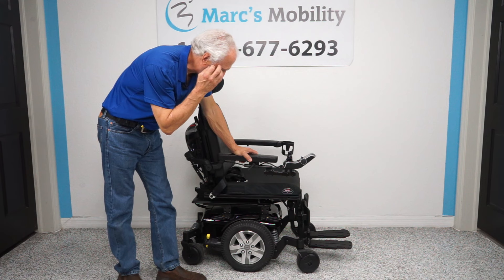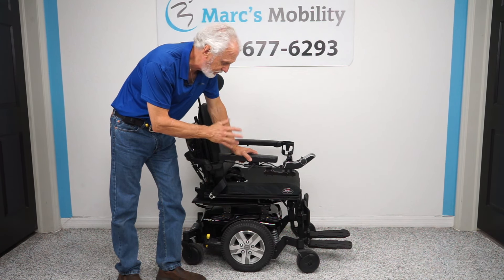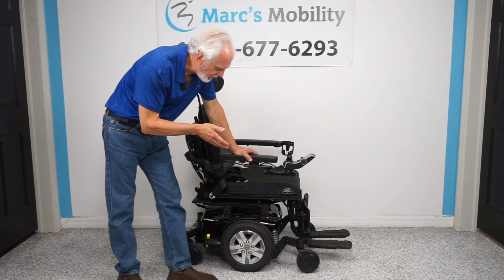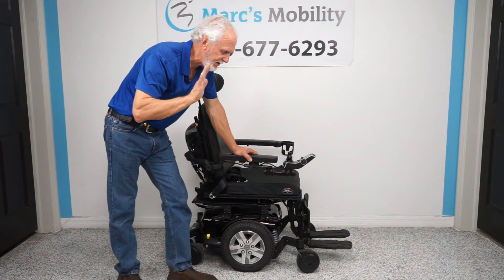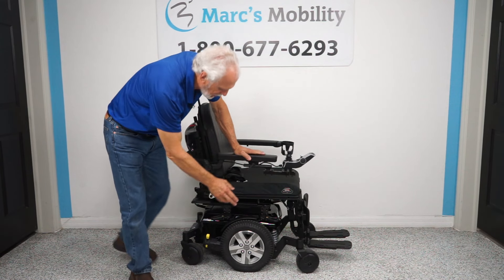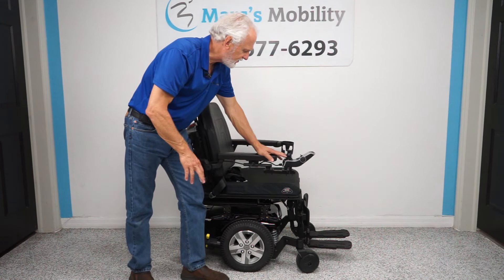We have a really nice chair here. Most of the chairs that come through my office are literally brand new, because we're very picky about the chairs we buy. This one has 19 miles on it and was used less than a month. It has electric tilt, electric recline, and electric feet. The color is shiny black — literally brand new, just about.